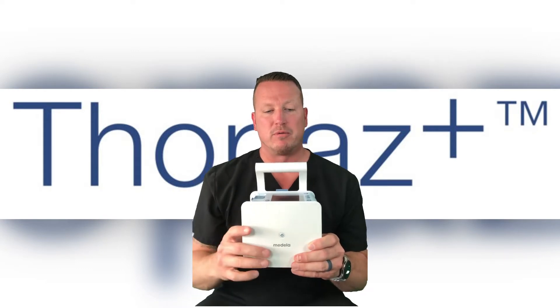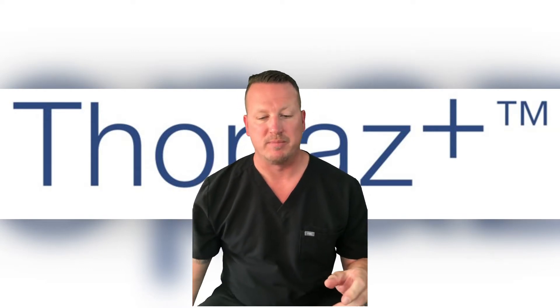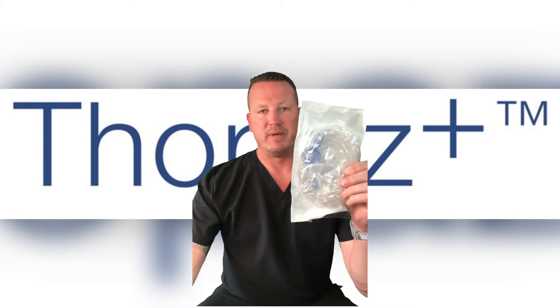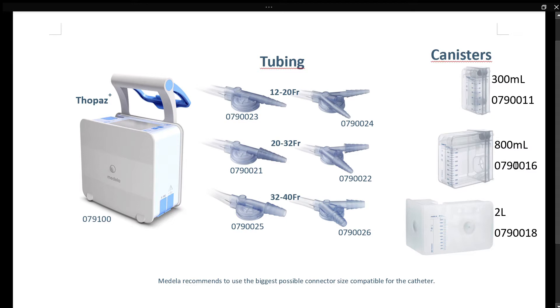There are two peripheral disposable components required with Topaz Plus: tubing and a canister. There are three sizes of tubing available — the 12 to 20 French, the 20 to 32 French, and the 32 to 40 French — each in a single and double configuration. There are also three sizes of canisters: 300 milliliters, the most commonly used 800 milliliter, and a 2 liter.